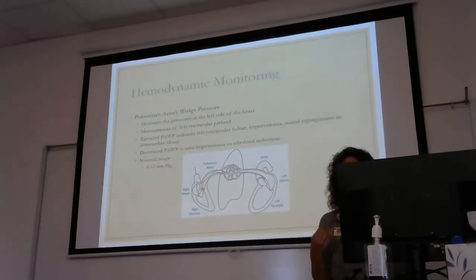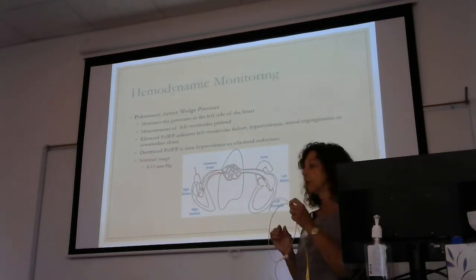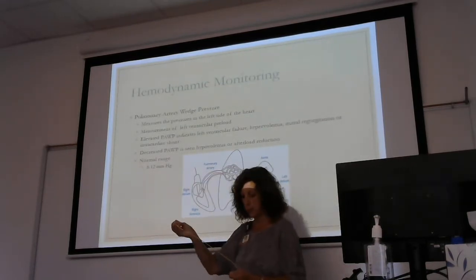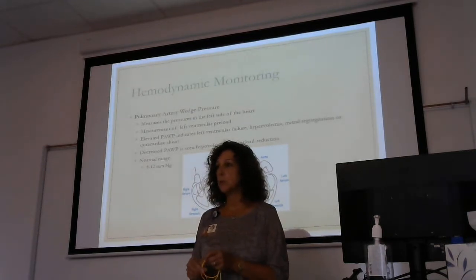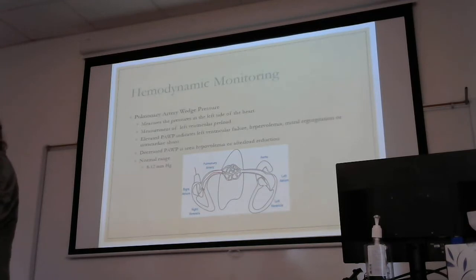But because of dangers associated with that, we don't do them anymore. There was a really serious complication, and it did occur, where this little balloon would get stuck in that pulmonary capillary bed. Now I want you to think about it, capillary bed. Are those things friable? What's friable mean? It's okay if you don't know, just tell me. They're gone. They're easily damaged and they easily bleed. So if I've got a balloon stuck there, and it only takes a few moments for those vessels to start to, what? To die. What's going to happen when they do? They're going to bleed. Do we have serious complications now? Yeah. We got bad problems on our hands, okay?